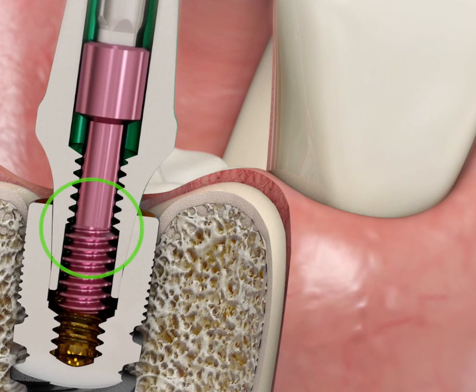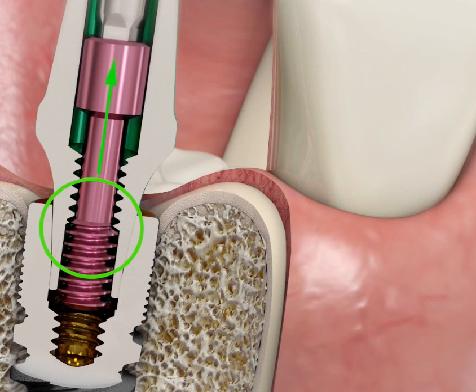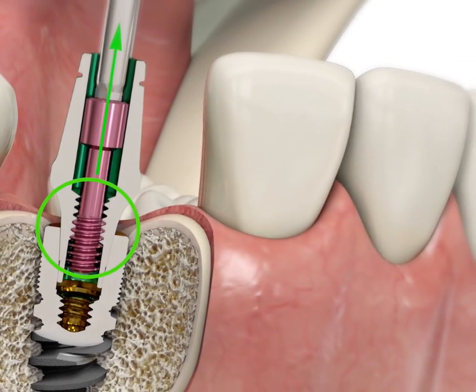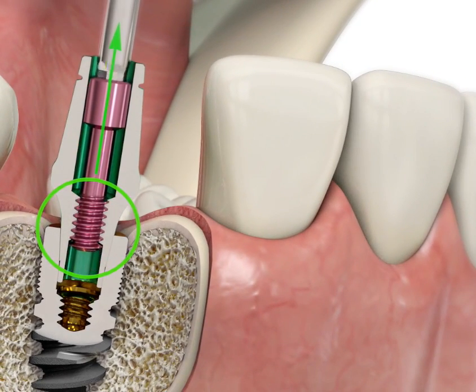If this happens, place the screwdriver back into the head of the fixing screw and this time rotate the screwdriver in an anti-clockwise direction while applying a gentle pulling force to the screwdriver.